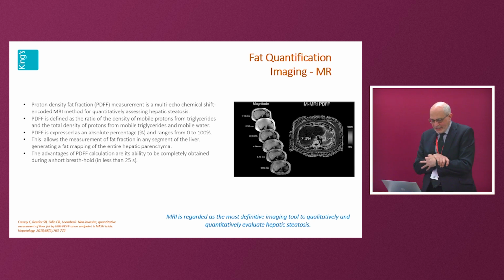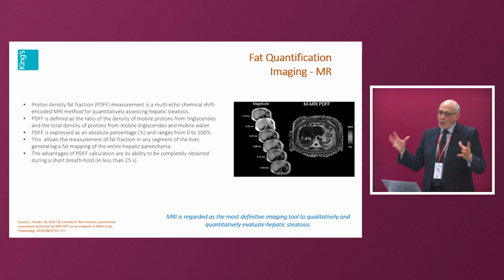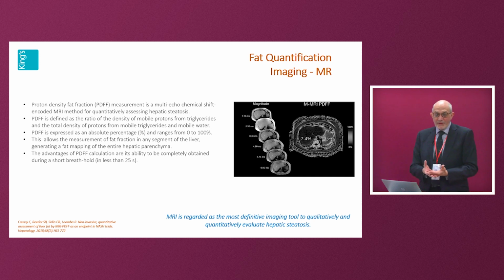What you are going to use, and you're going to use this more often, and it isn't a difficult MR technique to do, and it gives you very accurate quantification, and it gives you the whole liver quantification. A biopsy gives you a very small part, and we all know fatty liver disease is very patchy. MR gives you that global view.